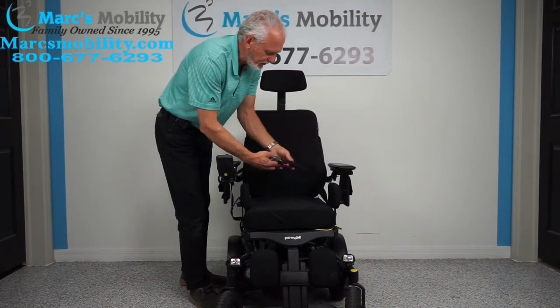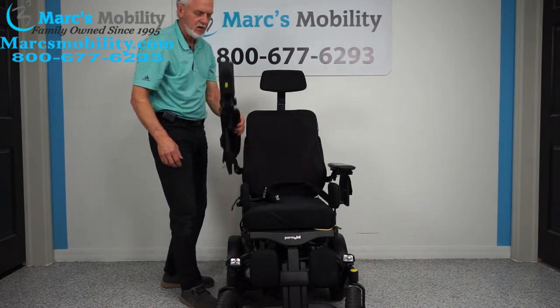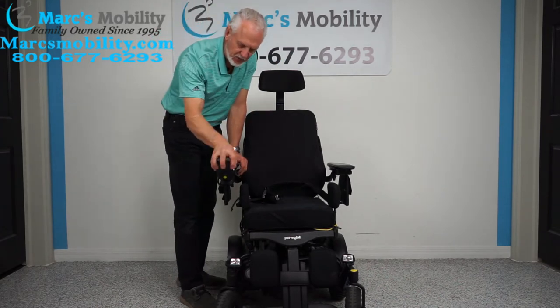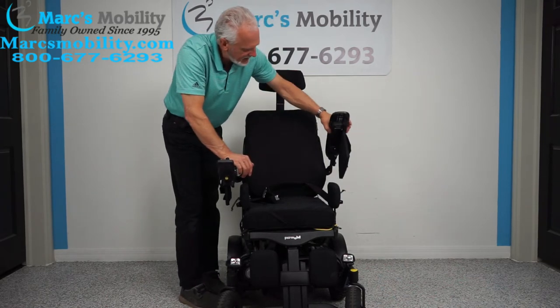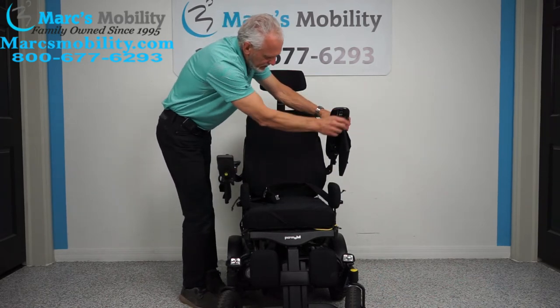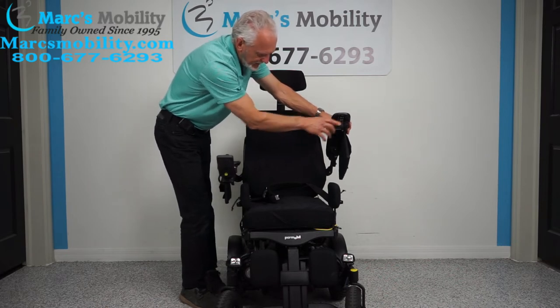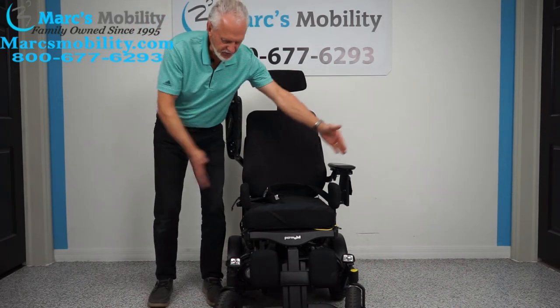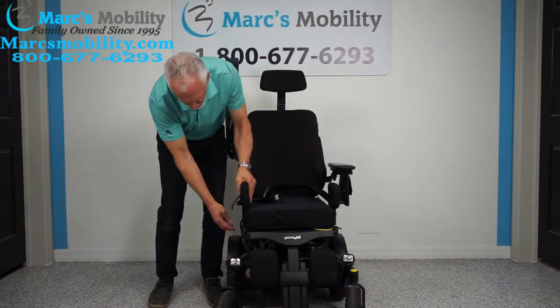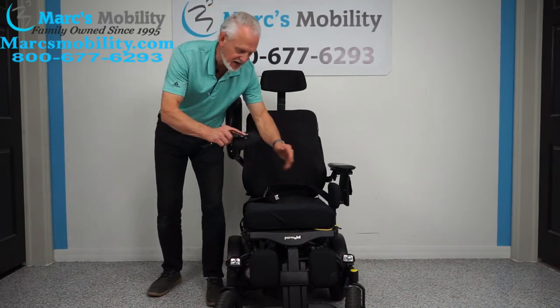There is a safety belt as well. If you're left-handed, we can put the joystick on the left side with no problem. On the left side you also have a USB port — so if you need to charge your phone, just plug it right in there. The arms also flip up, so if you transfer from the side, you can remove the pads and transfer on a board from side to side.